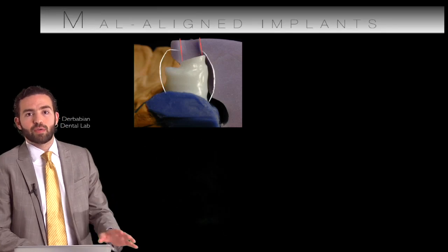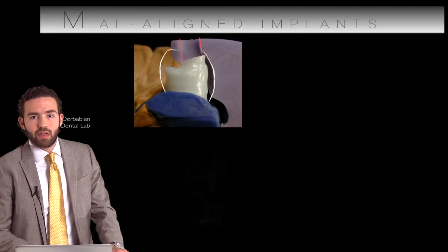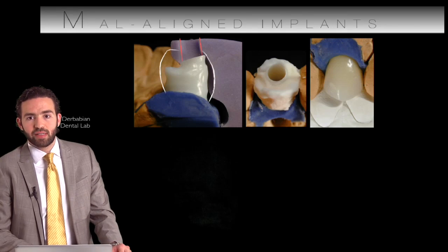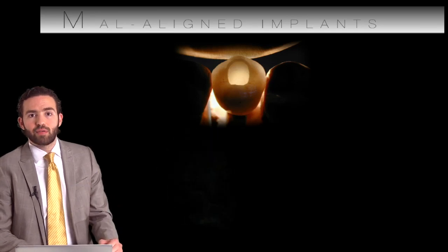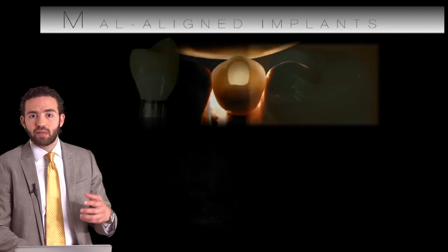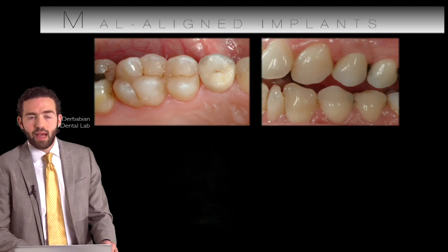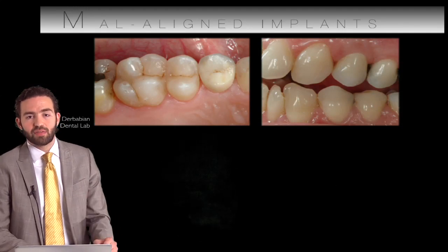But as we said earlier, zirconia restorations have the translucency option when it's in thin sections. So we see on the facial aspect a very minute amount of feldspathic porcelain has been placed, and that's how it looks on the facial aspect. And when we just shoot light from the facial view, you see how the light transmits really nicely through the feldspathic and the zirconia wall. That's because the zirconia is very thin over there. We kept the definitive restoration as screw retained, and you see here in the patient's mouth it blends really very nicely. You can't even tell which is which. And that's by proper manipulation of the material. That's how we got the successful result.